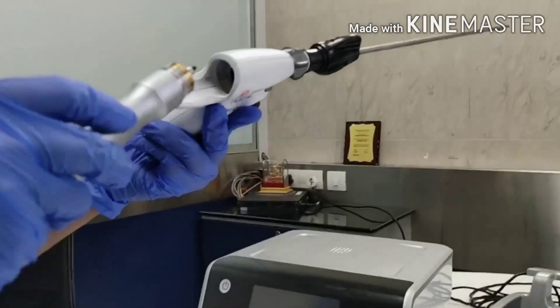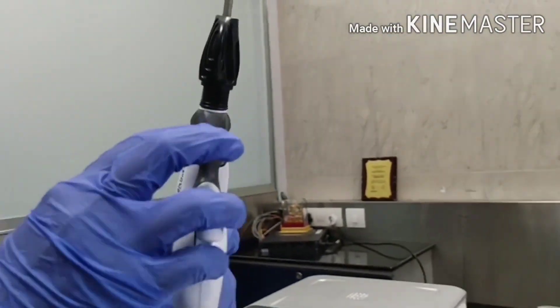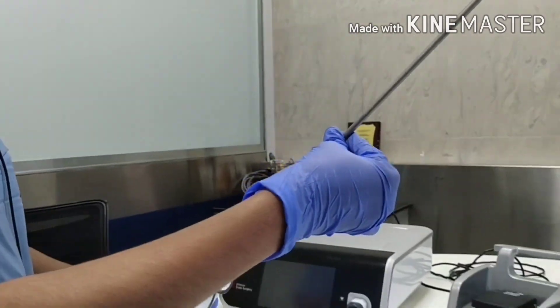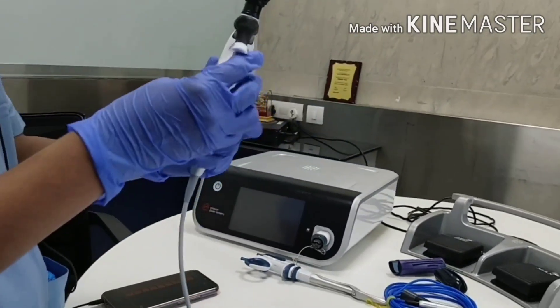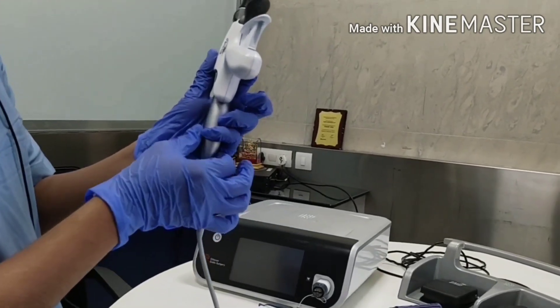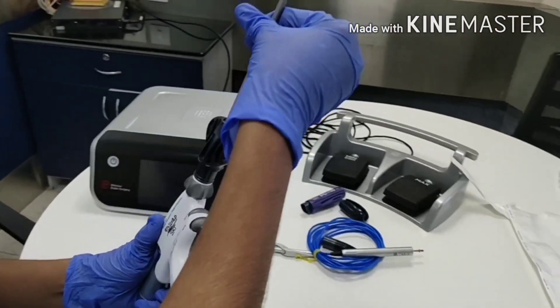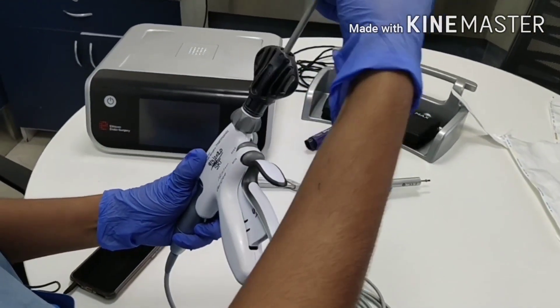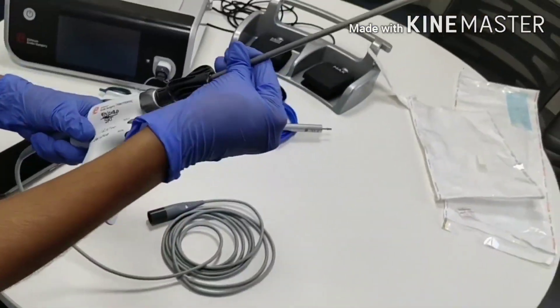Let's see how to connect the handpiece to the probe. Take the transducer — that is the handpiece — and insert it here. Hold it properly and rotate the shaft of the instrument. Do not rotate the transducer; it will damage the crystals inside. Rotate.